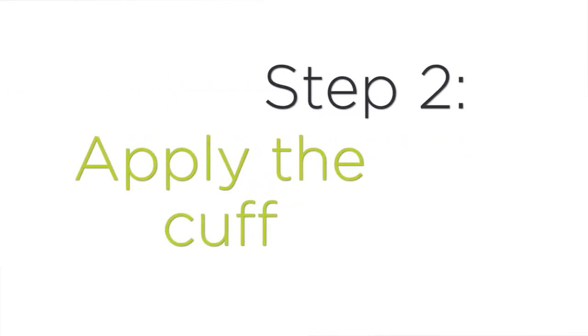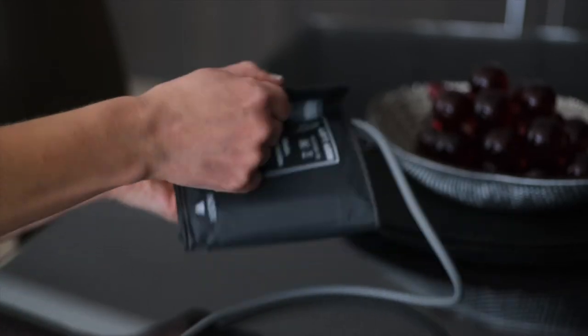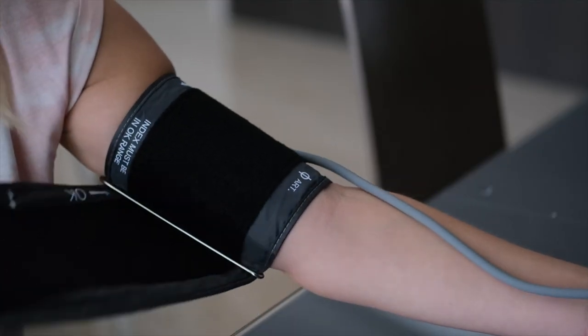Step two: apply the cuff. Use your left arm making sure to remove any thick clothing and rest your arm on a hard surface.